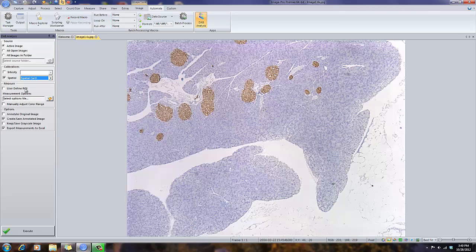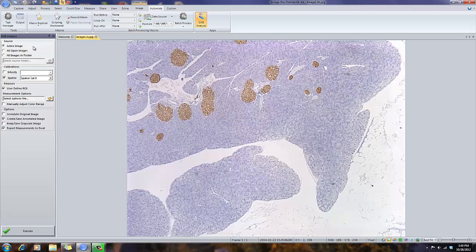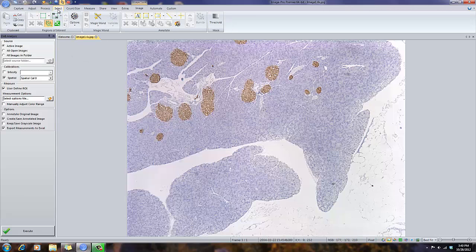We also have a choice now. We can measure the whole image, in this case, or if I select User Defined Region of Interest, I can define a specific region on the image to measure in. In that case, I simply go to the Select tab.